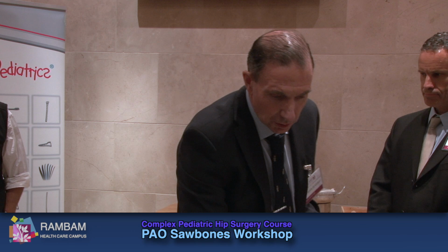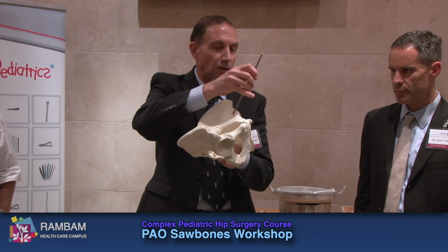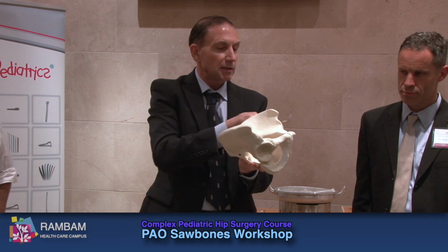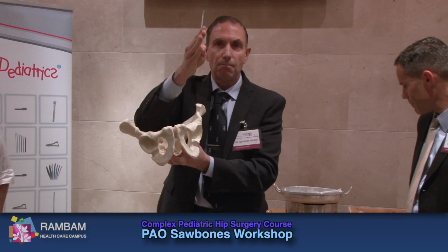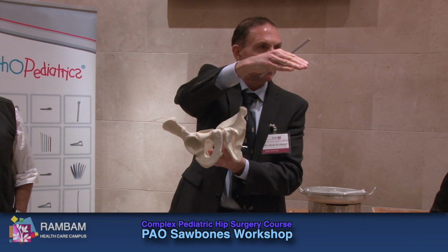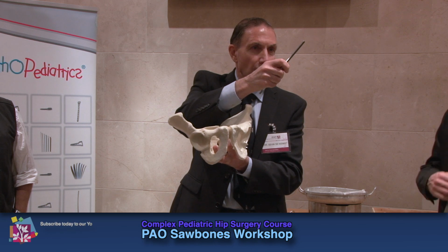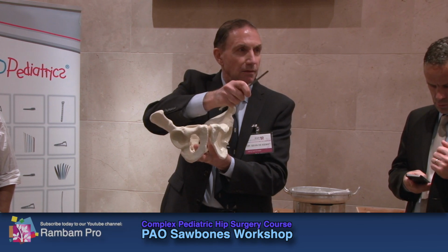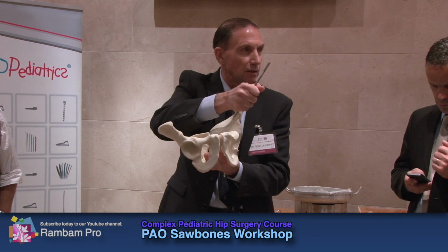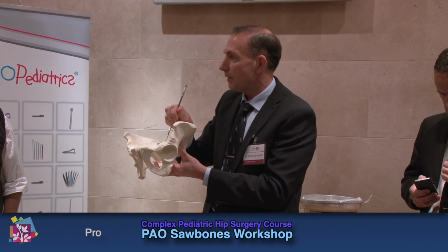And then in terms of doing your correction, you've got your Schanz screw in here, as Scott was saying, and you've got to correct. So this is an oblique plane, right? So if I correct like that, more of my anterior wall is going to cover it, anterior impingement. So I'm going to correct it this direction, I'm going to correct the version, that direction, all right? And then I'm going to medialize it. So you've got at least 3 maneuvers to correct the position. Then pin it, and then check the image intensifier, you've got the correction.